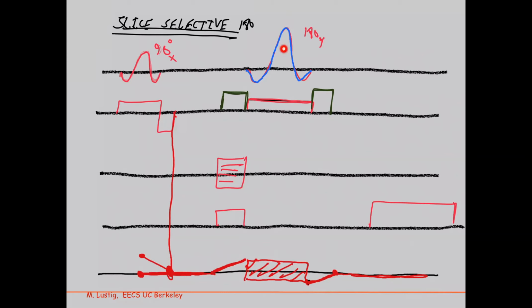The blue is generated actually here in the middle. So it's generated over here, and then starts dephasing with this at a slope. And then what happens here? Well, that even dephases it more. And then it stays straight.